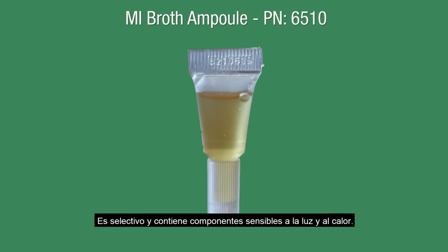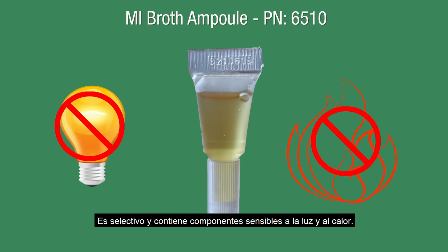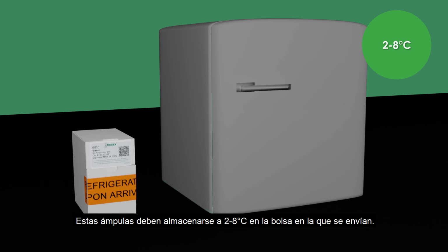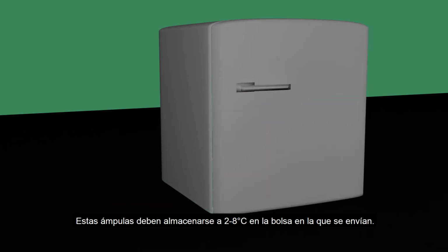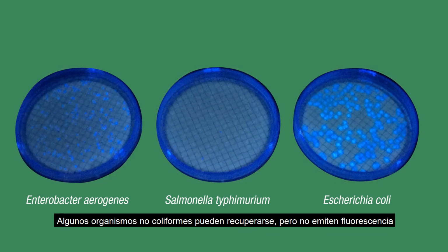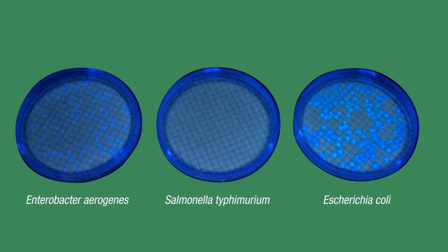It is selective and contains light and heat-sensitive components. These ampules should be stored at 2 to 8 degrees Celsius in the bag they are shipped in. Some non-coliform organisms may recover, but they will not fluoresce under UV long-wave light exposure or develop a blue color.